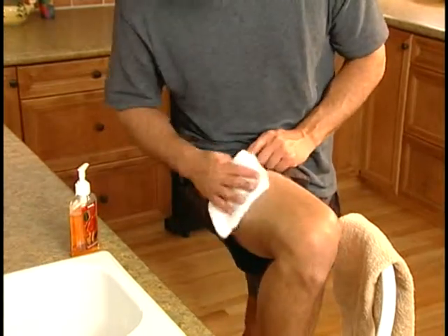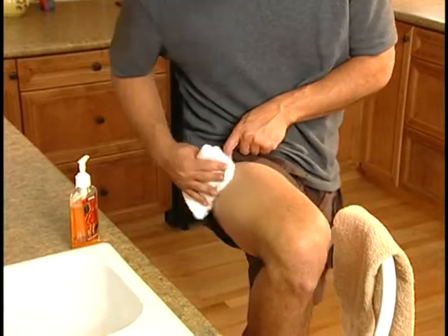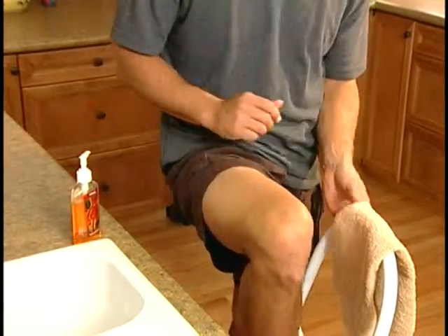Before taking a treatment, clean your skin with soap and water where the pads will go. You may also use rubbing alcohol if your skin is not sensitive. Make sure to dry your skin completely.